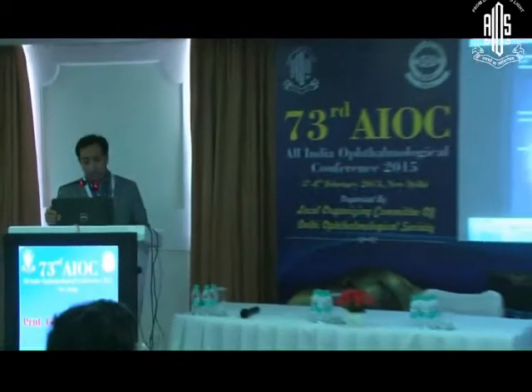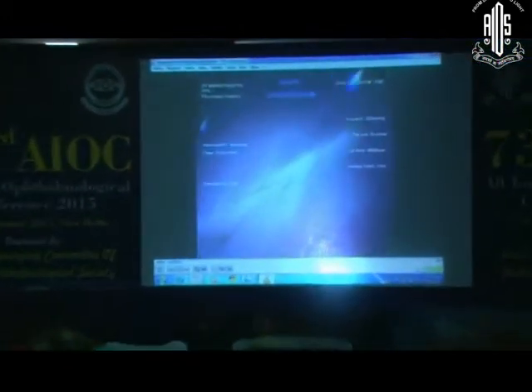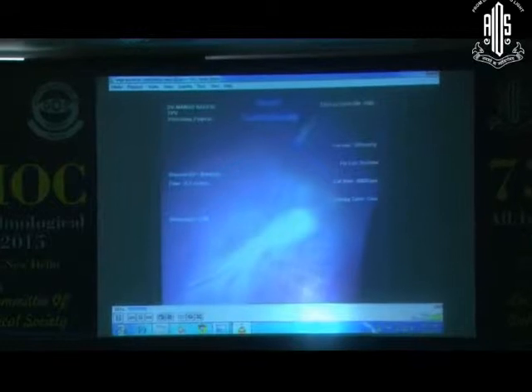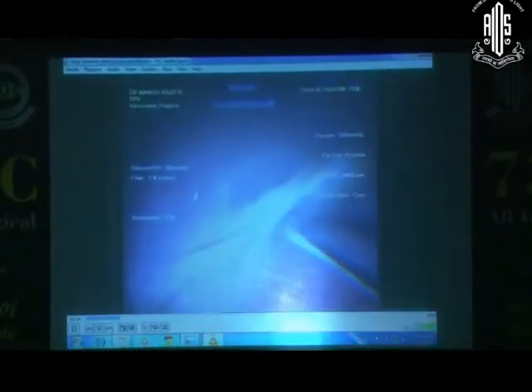This is a young girl who most likely had vasculitis-based residual sequelae, which you see as a tractional component spilling over to the macular area and reducing her vision. You can see that as the arcade on the superior side progresses, there's a stiff traction. So the aim of the surgery was to reduce the traction and resolve it on the macular area.